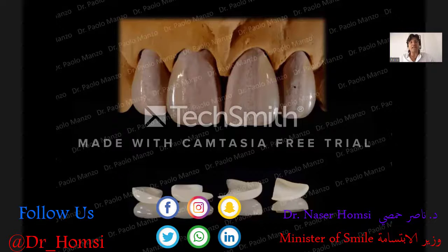The additionals is a very small piece of ceramics we can add distally or mesially to these teeth, and we can completely change the size, and we can also change the shape of the teeth. With these additionals, these are like veneers. They are a little bit more complicated to merge as color and as shadows to the rest of the tooth, because it's not covering all the facial aspect of the incisor, but it's adding only something distally or mesially, okay?